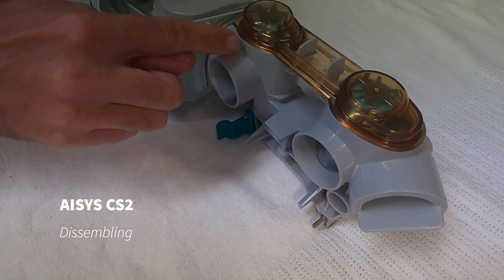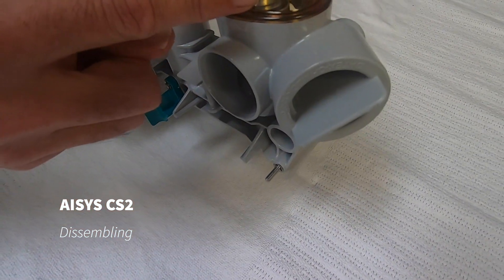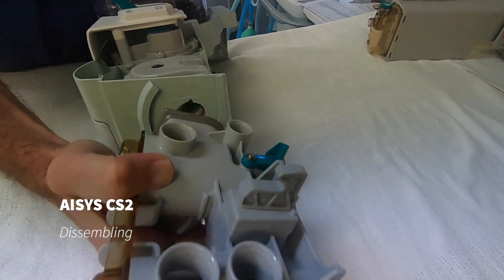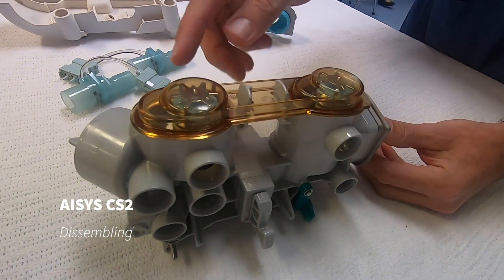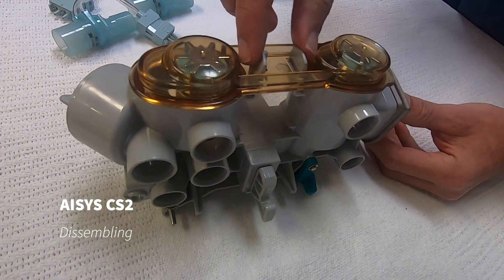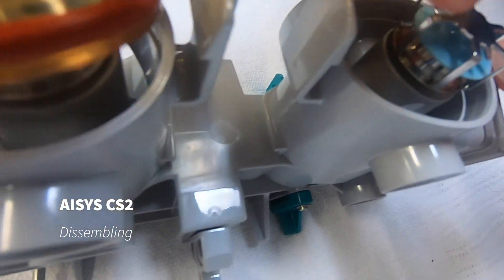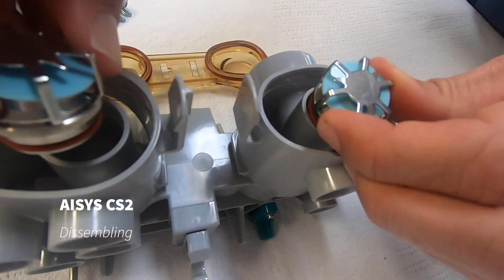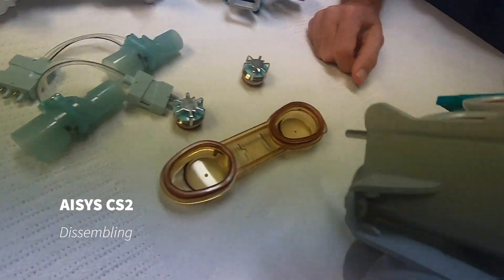Next, we're going to remove this assembly which has our unidirectional valves in it. To do that, we twist it and remove it. We then remove our unidirectional valves by pressing in the locking mechanism and lifting up the orange piece, and the unidirectional valves just lift up and out of place.